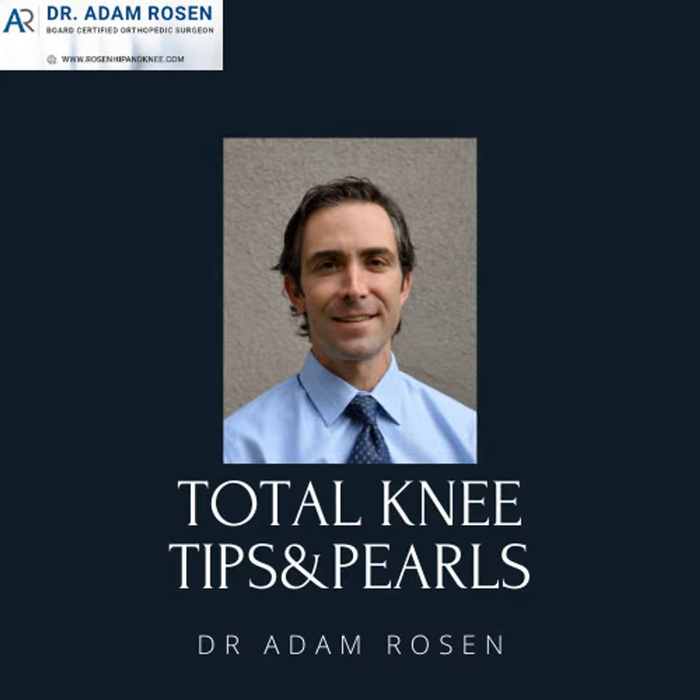So at this point, we flex the knee up, so we have exposure. And then I typically go to the femur first once I've removed the polyethylene insert. There are lots of options. You can use a small TPS saw, a small pencil-tip burr, or a Gigli saw. All options. In my hands, I just do it with a flexible osteotome.